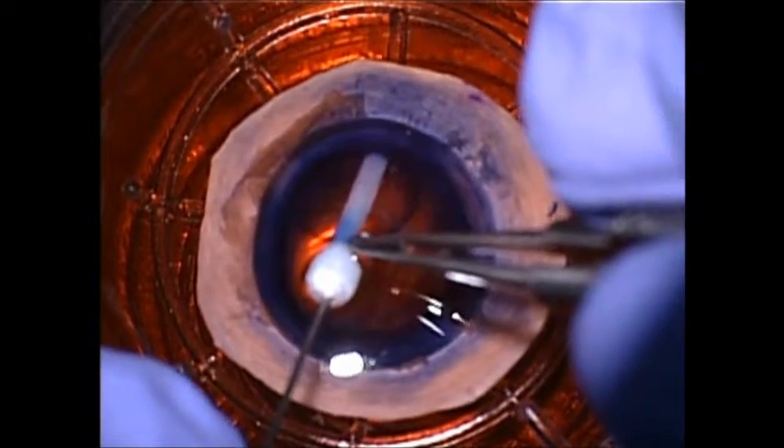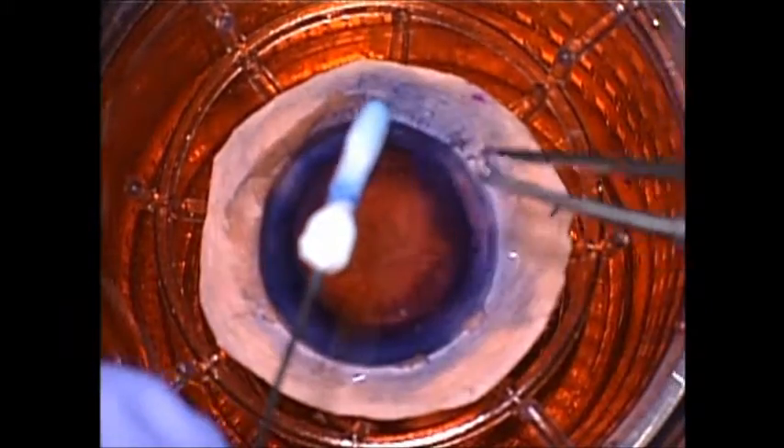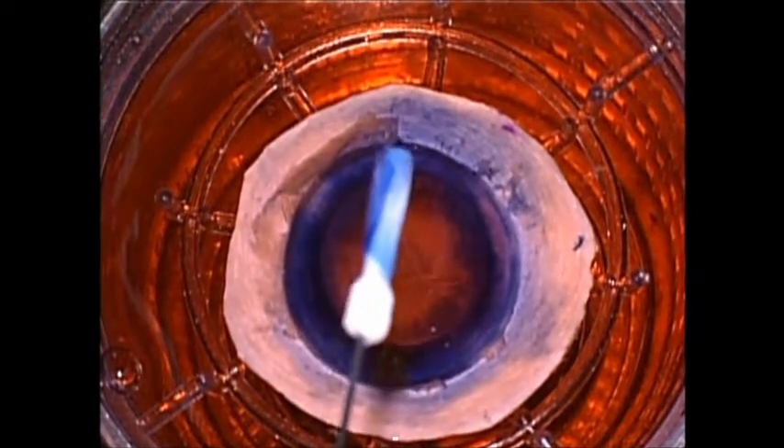When it's lined up in the proper position on the device, the device is then lifted out of the preservation fluid and the round graft drapes around the cylinder with some overlap on the underside of the cylinder, maintaining a known orientation of the tissue with the endothelium side out.